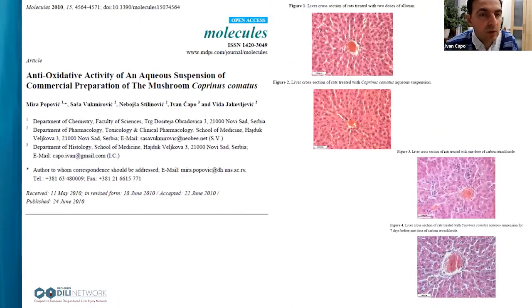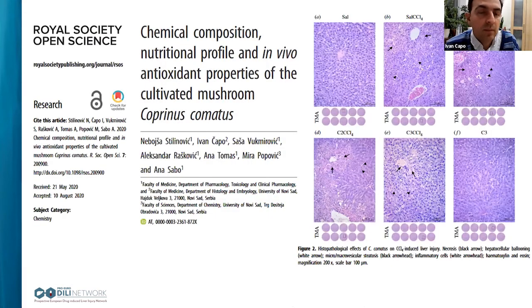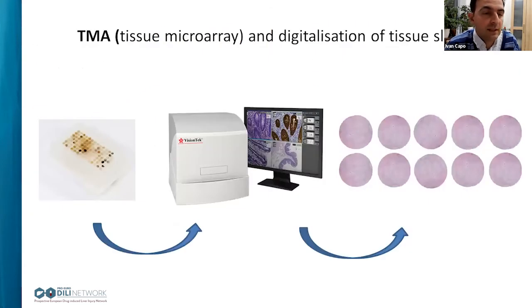The most important part of histology analysis is that we have some standardization of which region we use and how many slides we analyze. So the use of morphometry inside the histology analysis and also grading guidelines are the best part of histology analysis.